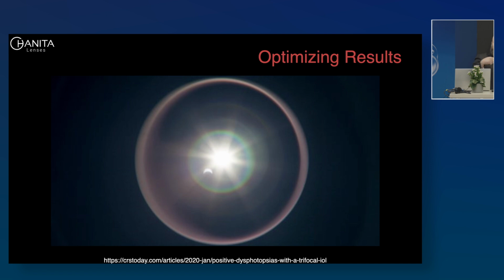So the night before the first post-surgical appointment, I tell them, the day before, you will go out and you will look at the lights and you will look for the circles. If you see the circles, that means that the lens is working. So the next day they get so happy. Yes, doctor, I see the circles. They are working. It's beautiful. It's gorgeous. We're changing the psychology of the patient.